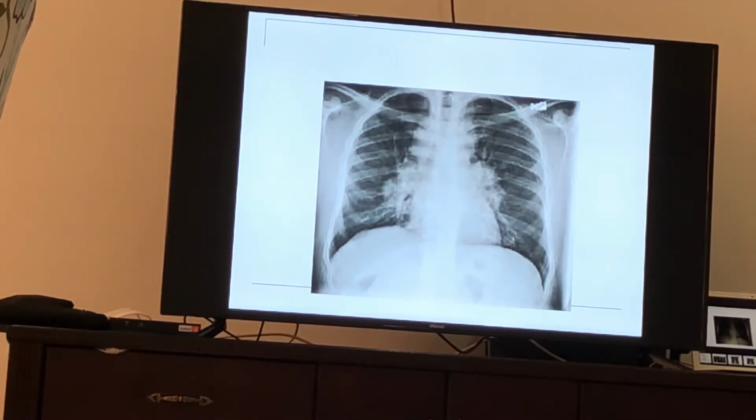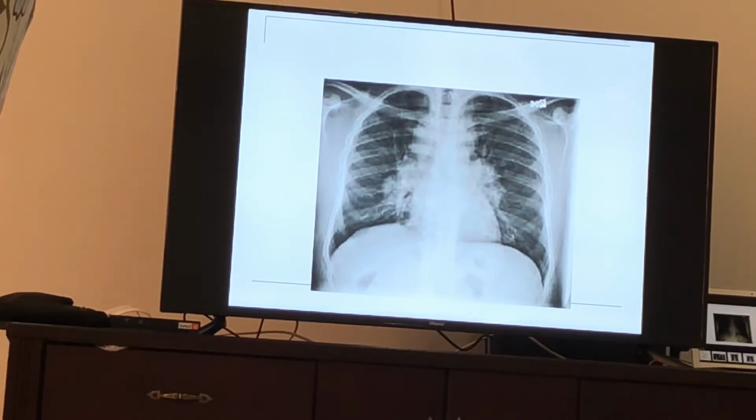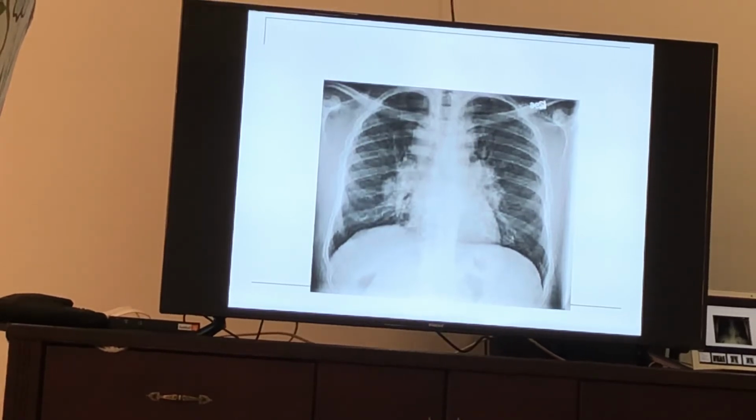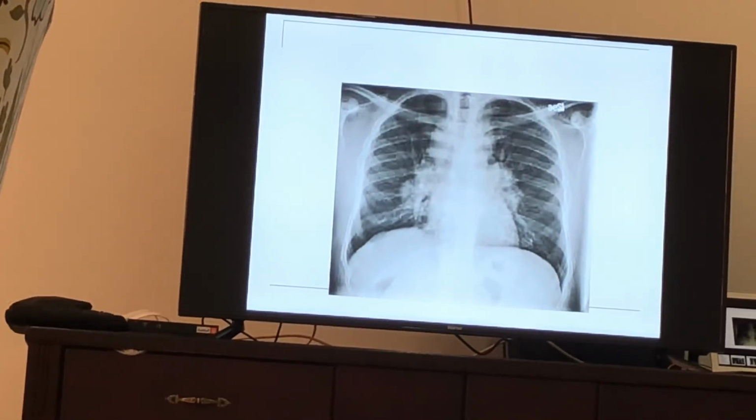Without dissection is more clinical. Achalasia is visible in the body. When the esophagus has a problem and is dilated, it will give widening. Any dilatation of the structures that are normally present in the mediastinum will give widening: the thymus, the esophagus, the aorta, any of them.